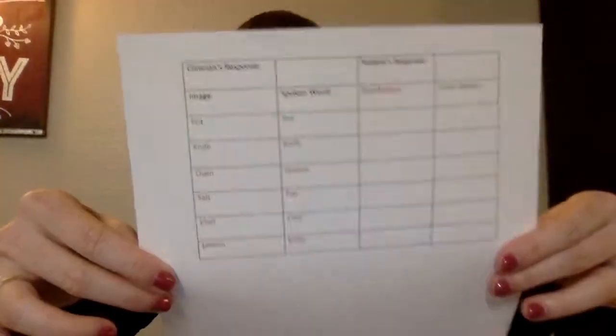No matter where they are with getting through them though, you will power down at 20 minutes because again, that's applying to the safety code with tDCS. So no matter where they are, 20 minutes, shut the device down. And while you are doing this treatment, you will have a data collection sheet to make things easier. This data collection sheet was randomized based off the words shown and the words spoken. And you would want to at least have maybe even 100 or more boxes with randomization as to what gets shown and what gets spoken, in case your clients get through a lot of words.